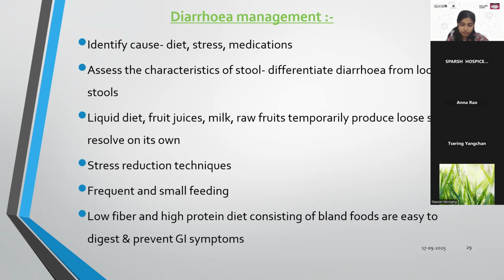For colostomy, one-piece pouch, it should be changed every 1 to 3 days. It may require emptying per day also, and the pouch itself should be changed in 2 to 3 days. Next slide, ma'am.